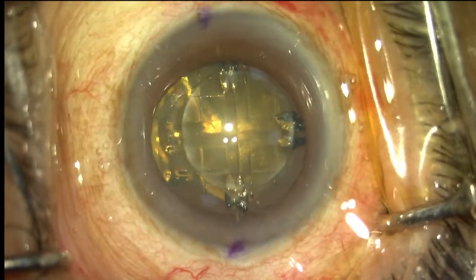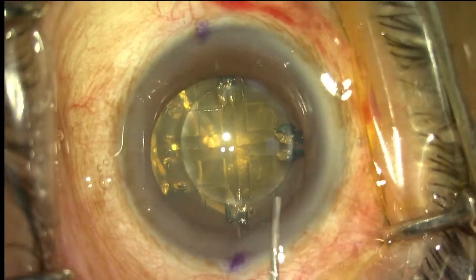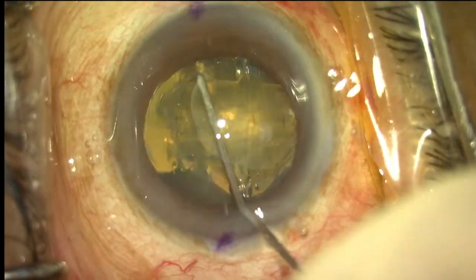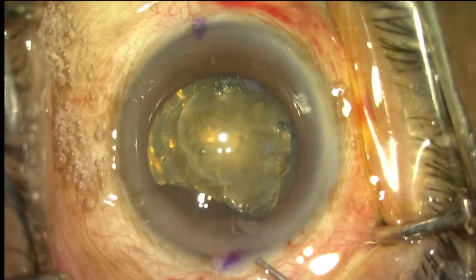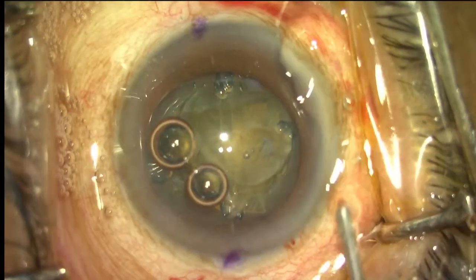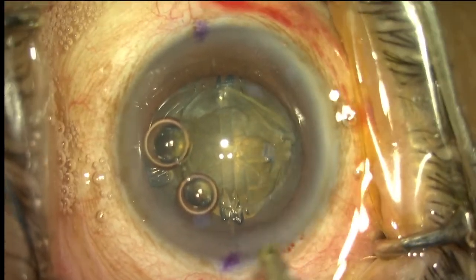As you can see, it's already a free floating capsule. The femto has been done with the Catalyst platform. I'll be doing minimal hydrodissection, since pneumodissection already happens in femto cases, so we need not do much hydrodissection.